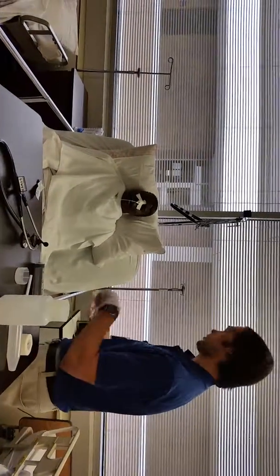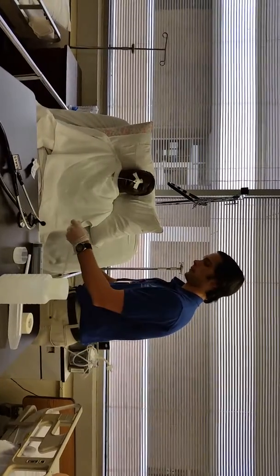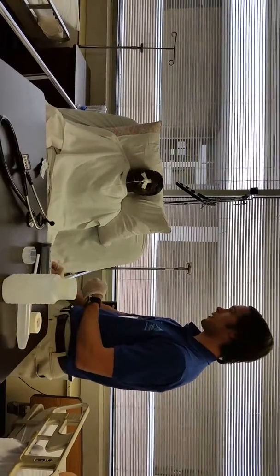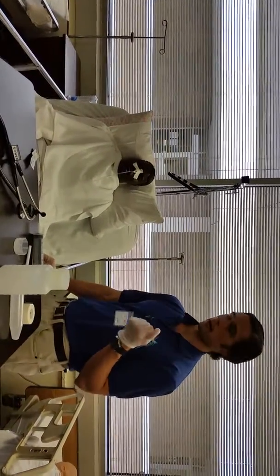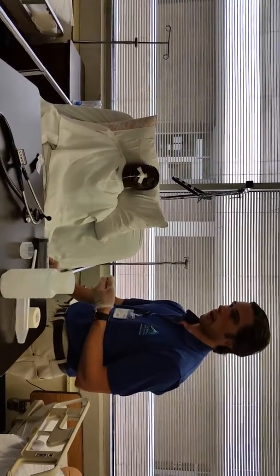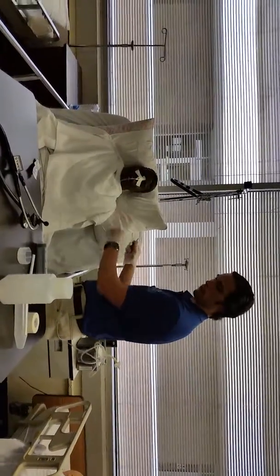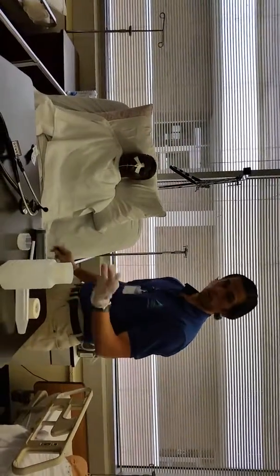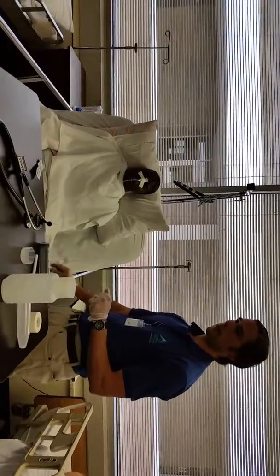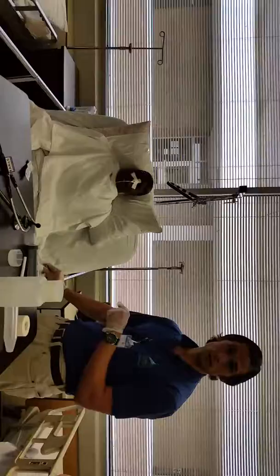I'll reconnect the suction. Look at the volume that's in the suction. I'm going to check the character of the fluid that's coming out and the color. After that, make sure there's nothing out of place for the patient. I clean up all my supplies, and then I would make sure the patient is tolerating the NG tube.